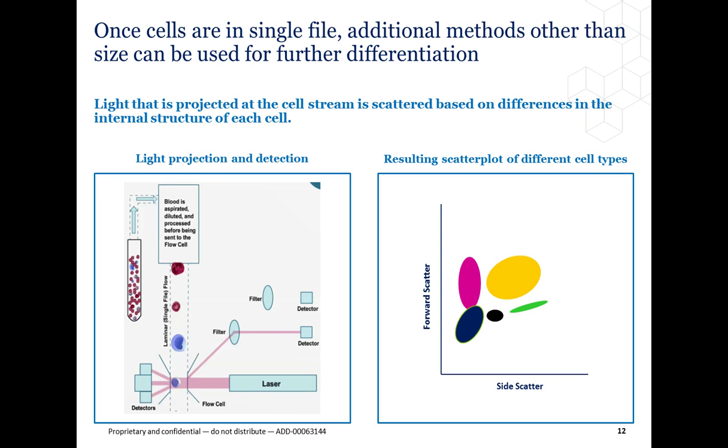The cells scatter the light at different angles. Actually, they scatter light in 360 degrees, but we're only interested in certain angles of light scatter. This yields information about the cell size, its internal structure, granularity, and even surface morphology. The optical signals the cells generate are detected and converted to electrical impulses, which are then stored and analyzed by the computer system after the analysis.